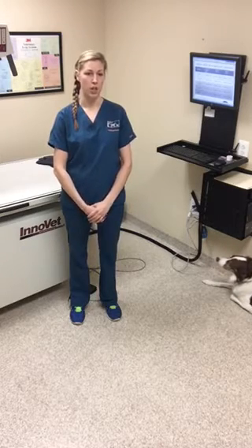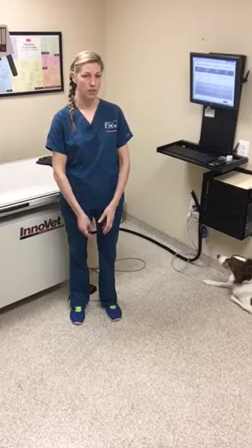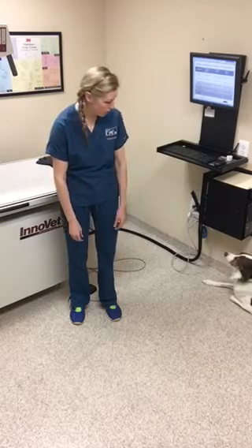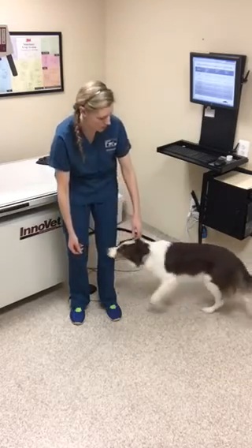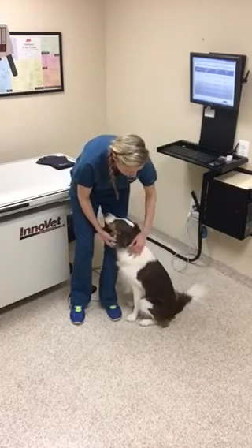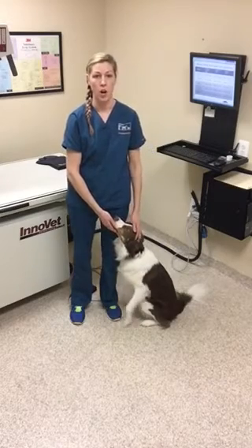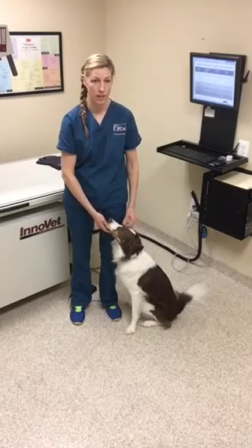The technique chart we are going to create today is a variable KVP chart formulated using a series of trial and error exposures. It is necessary to standardize as many variable factors as possible before starting the trial exposures. Once this is done, you will need to select an appropriate patient. An average sized dog, so one that is about 40 to 50 pounds and has a lateral abdominal measurement of 15 centimeters, with a clean coat and that's either calm or anesthetized, is an ideal candidate.